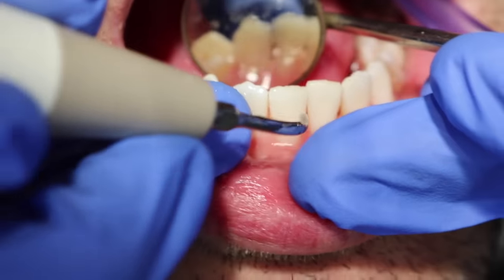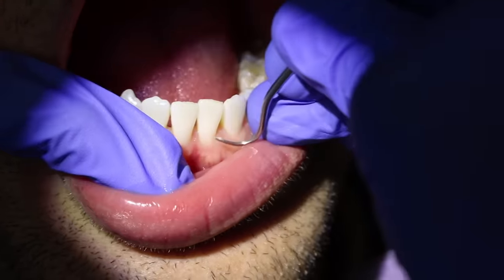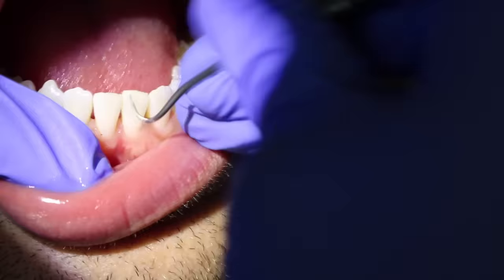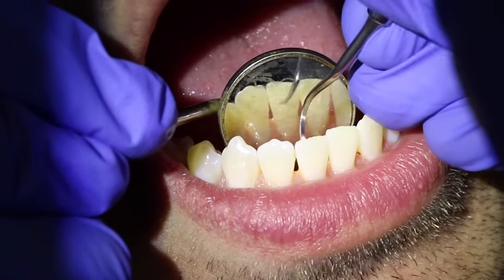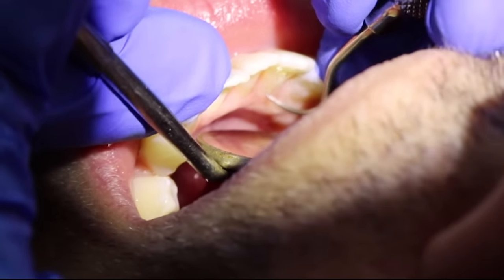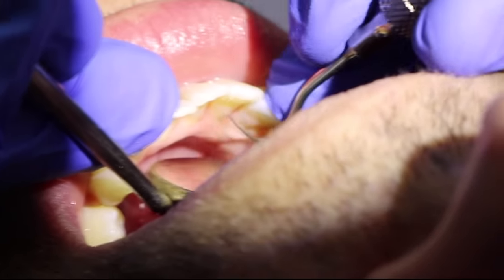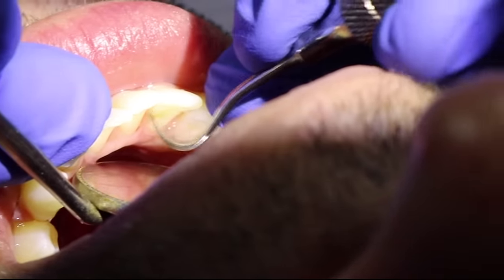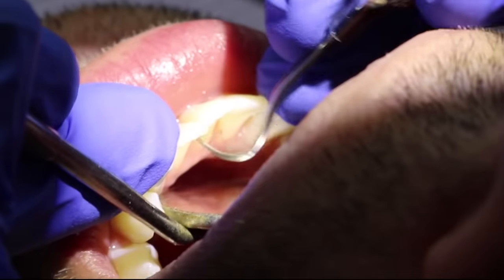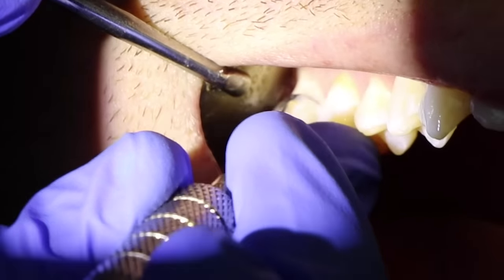After I'm done, you can see that I'm using the regular hand scaler. After completing all the surfaces with the ultrasonic scaler, I go back and clean all the surfaces with the hand instruments. There are different hand instruments for different teeth — anterior ones for the front and posterior ones for the back. I go through the whole mouth again, making sure we clean every single surface of every single tooth properly and thoroughly.